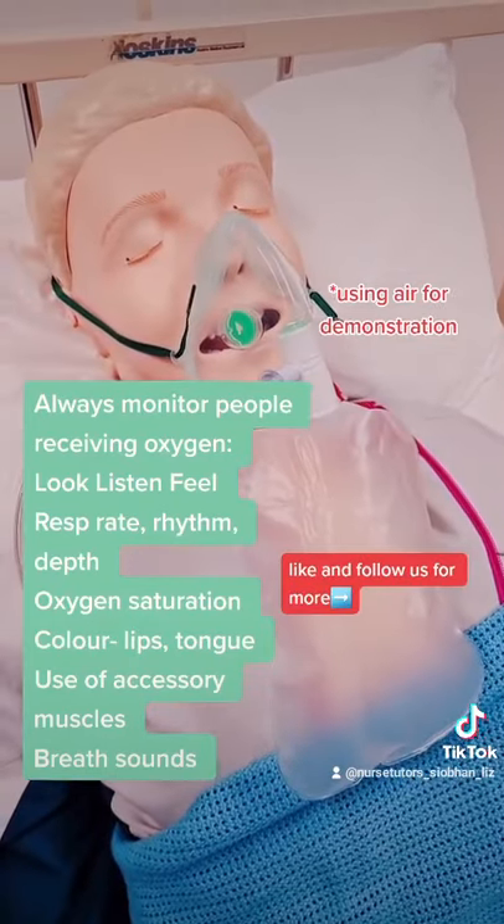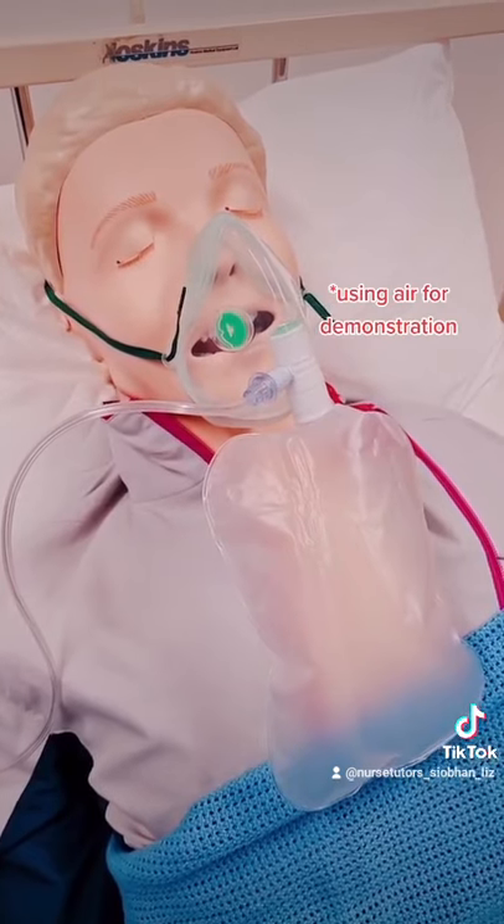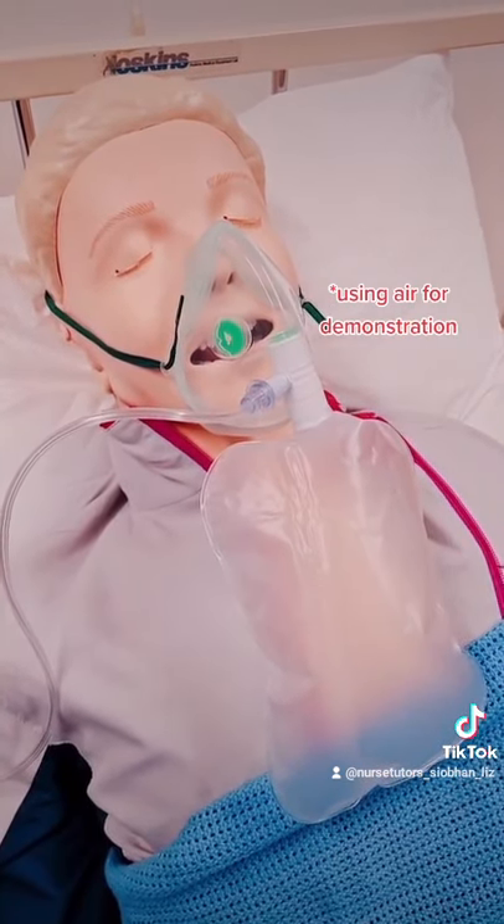The reservoir bag should always be filled at a flow rate of at least 12 to 15 litres per minute — never any less than this.